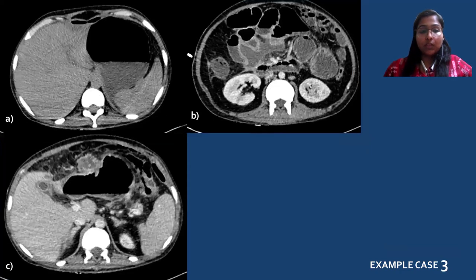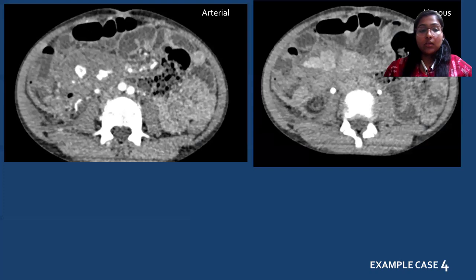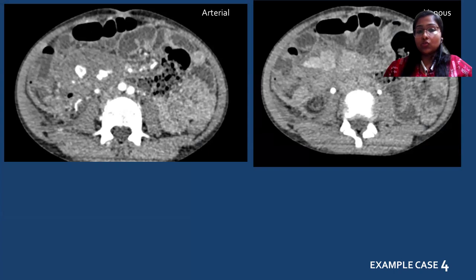This was a 45-year-old male with RTA. In the second image, against the jejunal loops, a collection was forming with multiple air foci. In the third image, a discontinuity in the bowel wall could be visualized. Next, a 10-year-old female presented with RTA and a mesenteric hematoma; the arterial phase shows a contrast blush which was seen to expand on the venous phase, indicating active bleeding from ileal branches of the SMA. The site of perforation was confirmed intraoperatively.